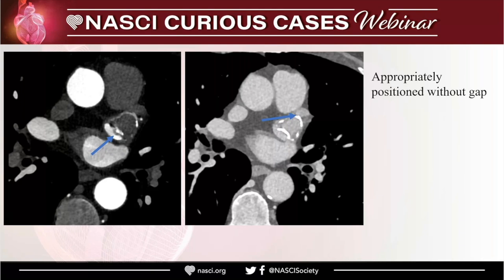Okay, because of interest of time, I'll go ahead. When they put these devices in, it takes time to endothelialize and obliterate the left atrial appendage. What we agreed on, from different publications and when we last discussed at NASCI, was 45 days to 6 months. If the patient is within 6 months, you can term it incomplete device endothelialization.